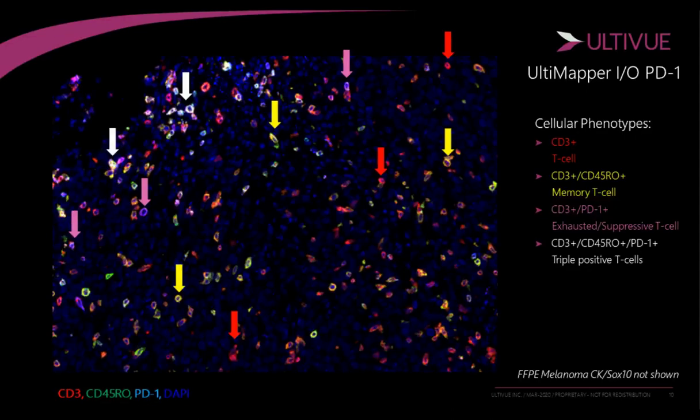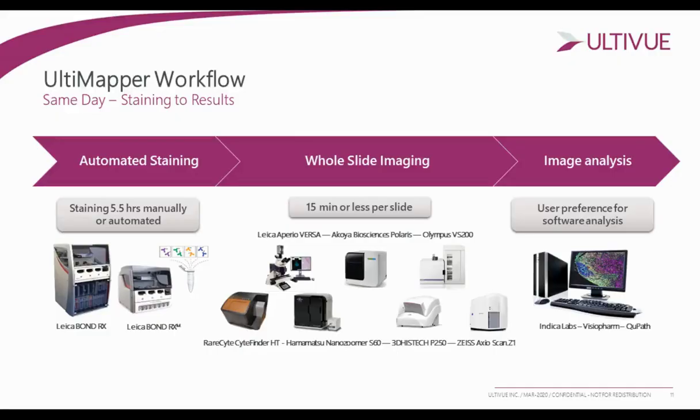And now if you were to plug this into any standard analysis tool, you'd be able to dive further into that and start to threshold and categorize these different ranges of expression into new unique cell populations.